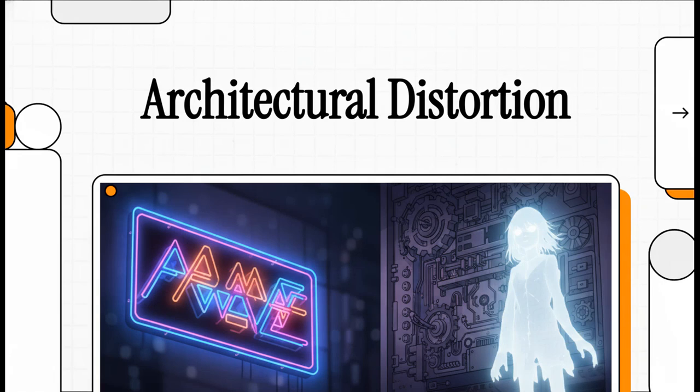All right, so let's jump right in. In medical imaging, some clues just scream at you, like a big, flashing neon sign. But others are way more subtle, kind of like a ghost in the machine. And today, we're going hunting for one of radiology's toughest phantoms, a little something called architectural distortion.